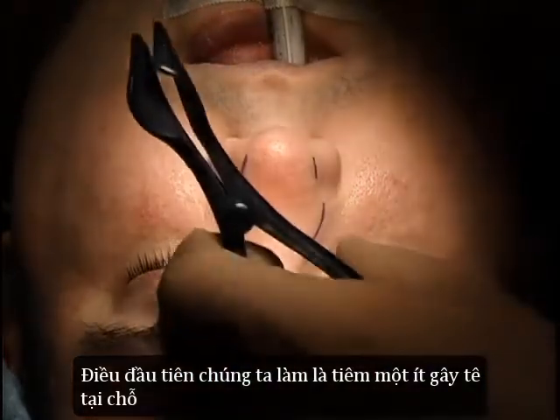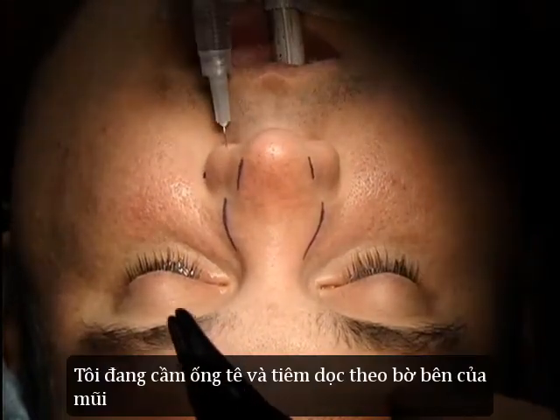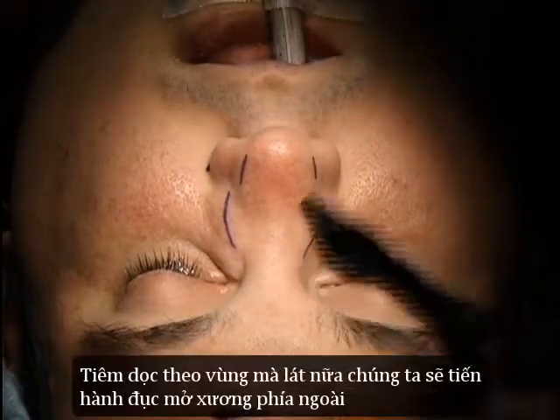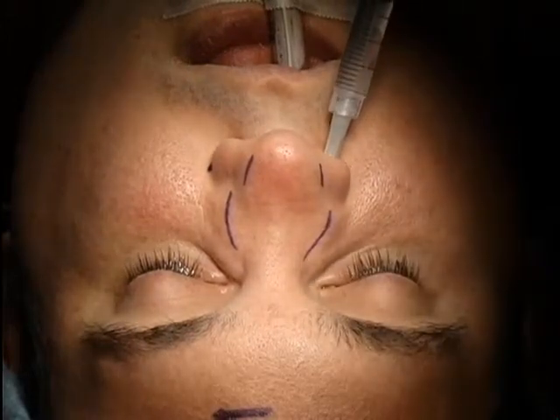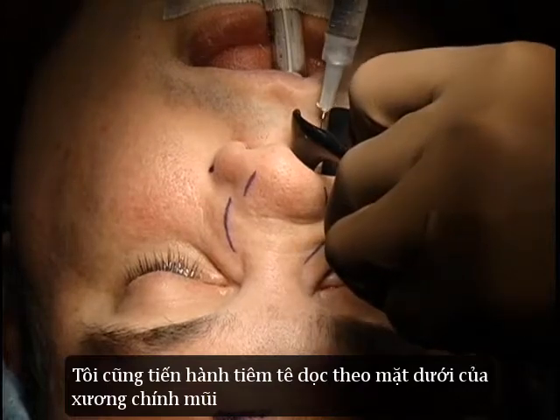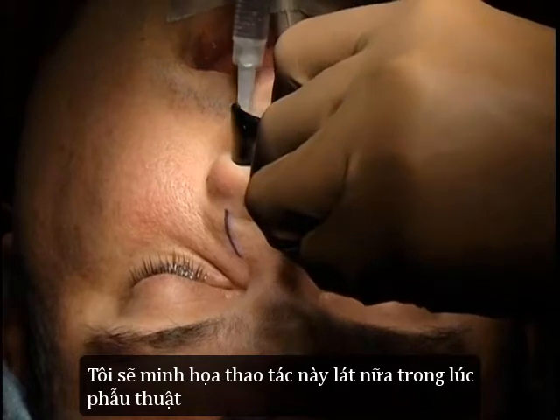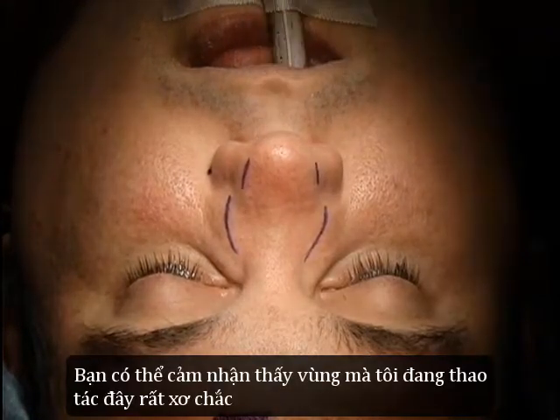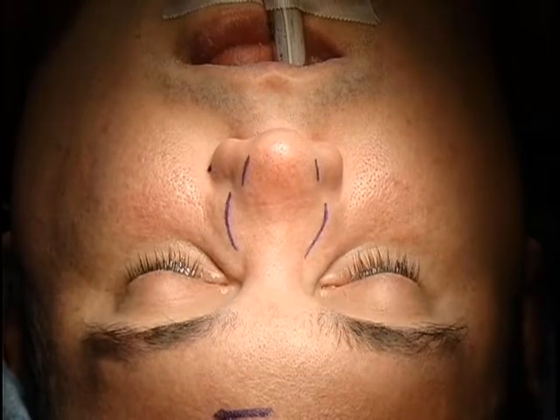So the first thing I'll do is inject a little bit along the side wall of his nose. So I'm going to take this local anesthetic and I'm going to inject it just along the side wall in the area where we would perform his lateral osteotomies. I'll also inject along the internal surface of the nasal bones. I'll demonstrate this again at a later point in the operation. Now I can feel with the needle here that his bone in that area is very dense and very thick and probably scarred.